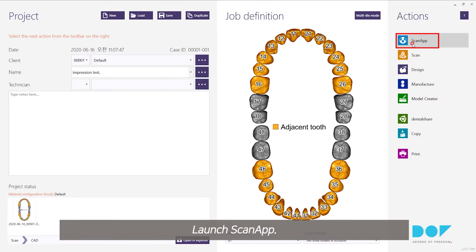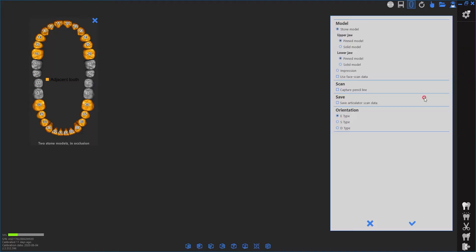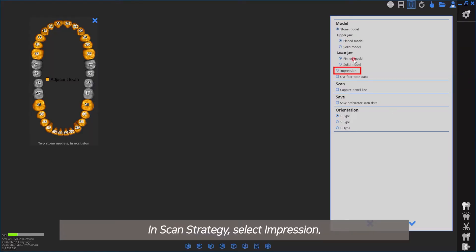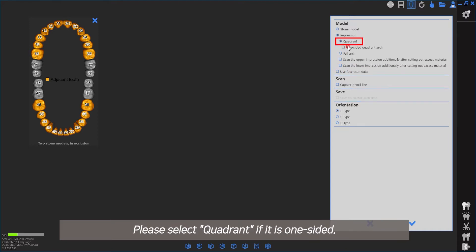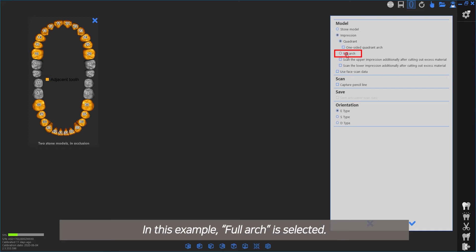Launch Scan App. In Scan Strategy, select Impression. Please select if it is one-sided. In this example, Full Arch is selected.